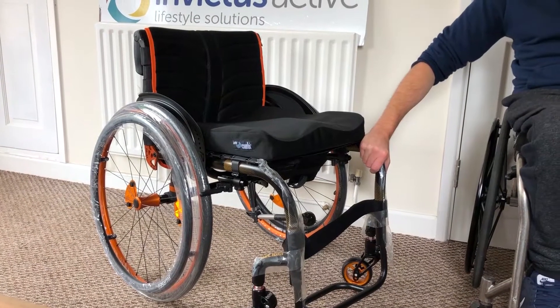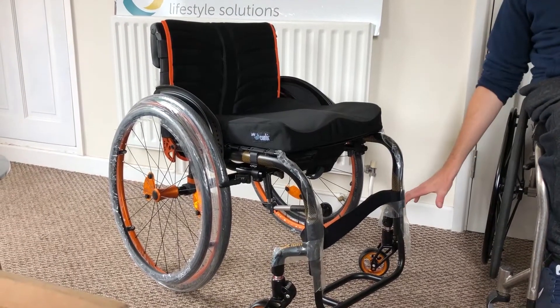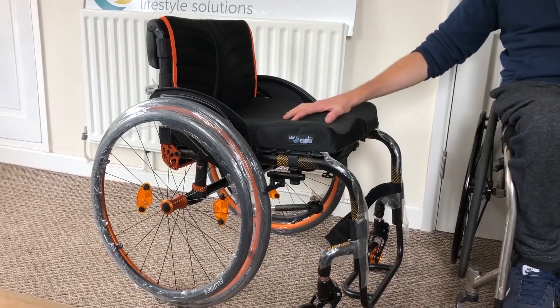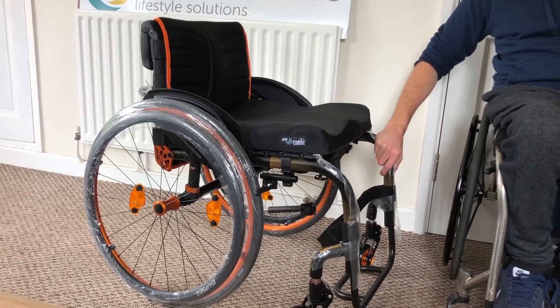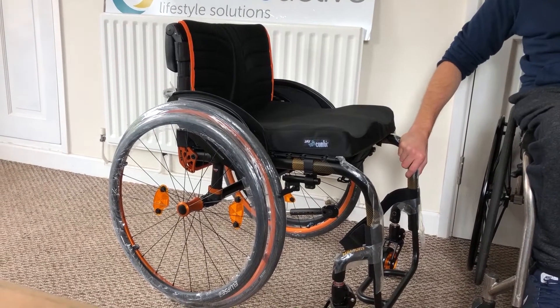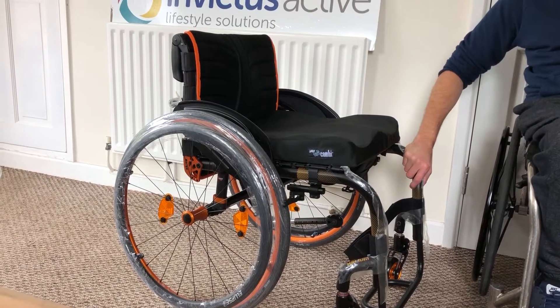Hi, it's Scott from Invictus Active. We've got a Quickie Helium wheelchair with a lot of extras, from the Frog's Legs caster wheels to the orange binding tape and a great cushion. We're just going to run through a few of the features that the customer has gone for on this chair, just to explain them if you were considering having these on your own chair when placing an order.